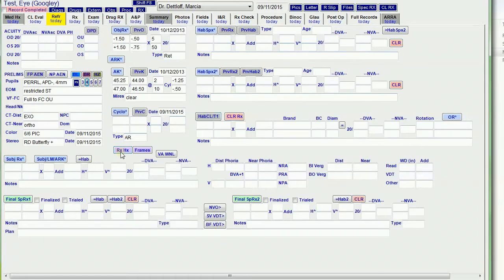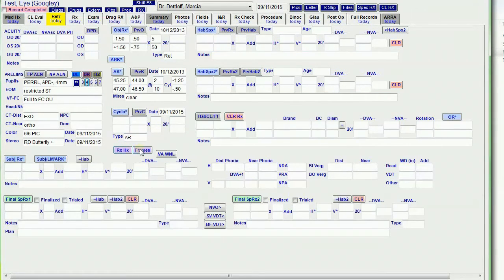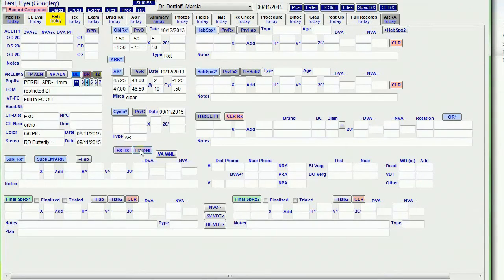And RX history opens up the RX history window. Frames opens up the frame order window. So a lot of times I'll use that to see what's the latest prescription that the patient's wearing.